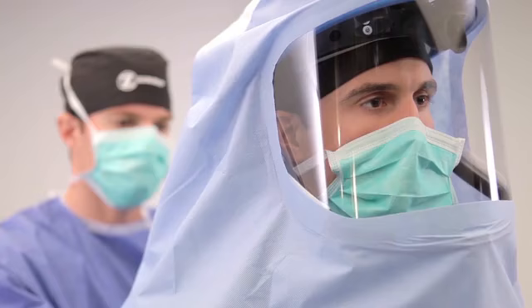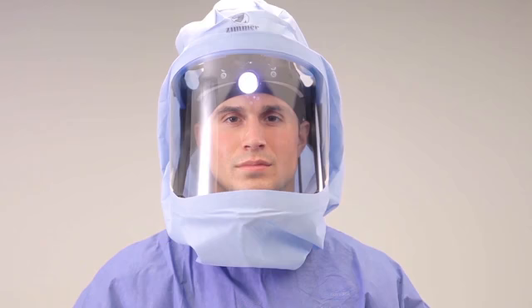Have your non-sterile surgical mask untied and removed. Now let the hood unfold over your shoulders. You can then put on a surgical gown over the hood and complete your gloving protocol. You are now ready to enjoy the comfort and protection of Zimmer's Total Shield Surgical Helmet system in your personal operating environment.